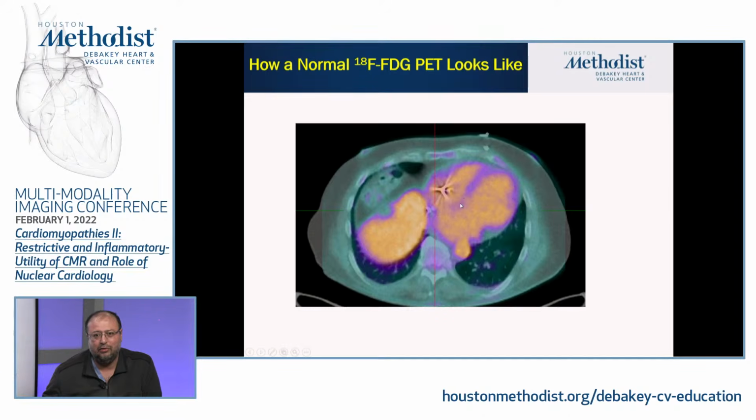There is no FDG in there, and the FDG is all sitting just in the blood pool, and this is a normal study. So FDG in the blood pool, and no uptake in the myocardium. You see the same thing in the right ventricle.